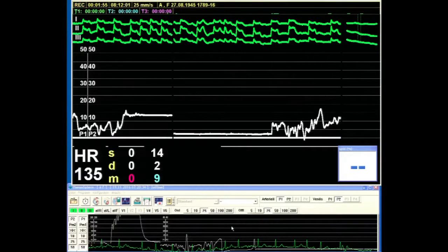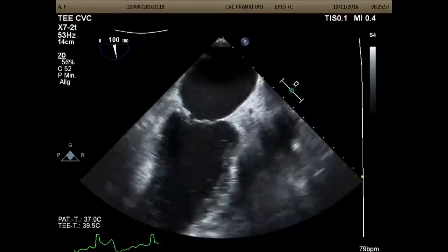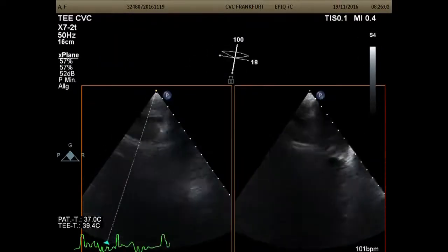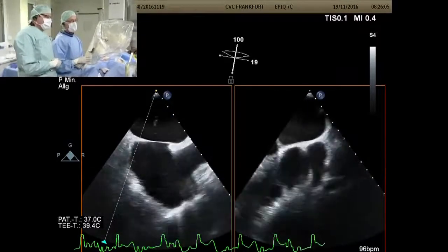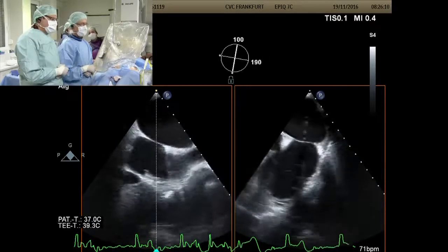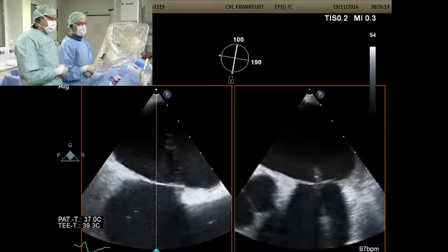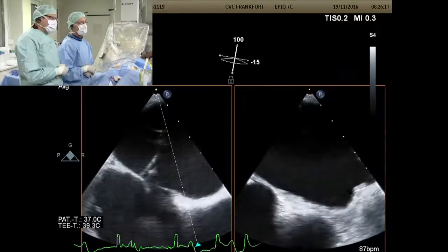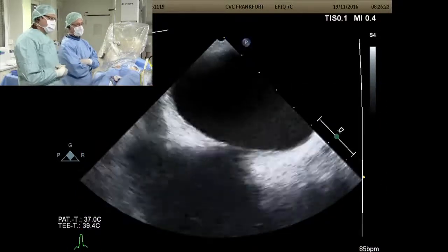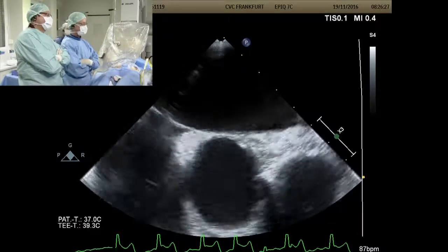Busha, do you see anything special? We have ST elevation changes. Yeah, we're looking. Despite carefully de-airing the sheath, something is wrong here. Any thrombus, any clots? Just look at the LV. Yes, given heparin 10,000. It's just worth thinking about, isn't it? Because these are comorbid patients, obviously not particularly this one, but... I'll put it in 3D. Nothing obvious. Every now and again, I think you've got to be careful about a rapid 500 or 1,000 cc transfusion.